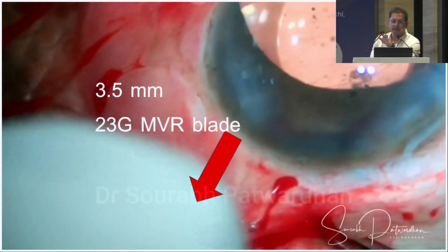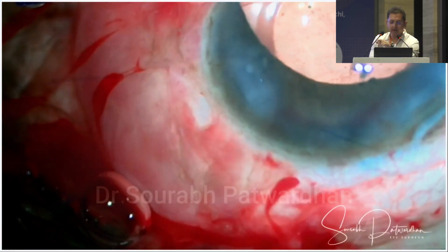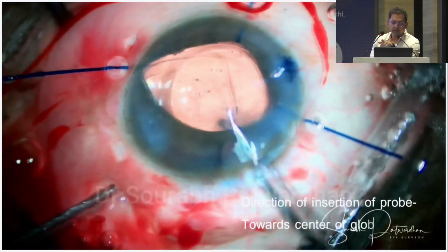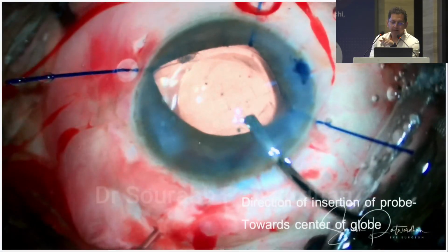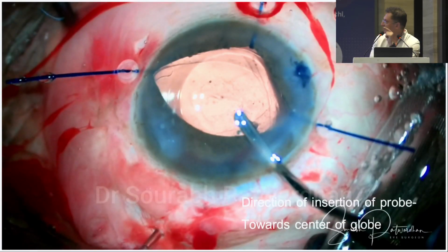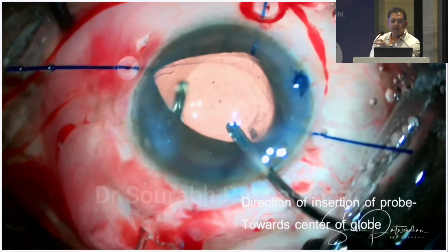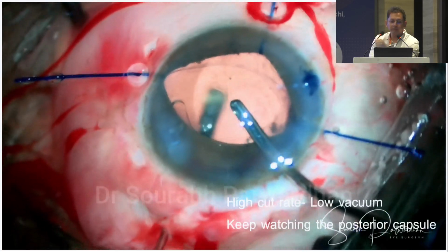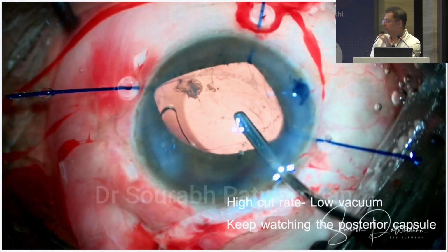You can clear the conjunctiva a bit and then pass through, so that you can visualize the scleral area where you have entered when you are using the 23 gauge cutter here. So you can see that now the 23 gauge cutter will go behind the bag there. The irrigation is still in the anterior chamber. What this does is that it debulks the vitreous behind the bag. So there will not be any more vitreous which will prolapse out when I remove the iris hooks. And it will also remove the fluid which has been misdirected towards the posterior segment.